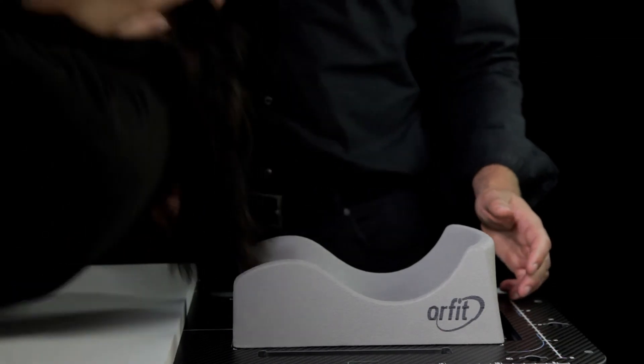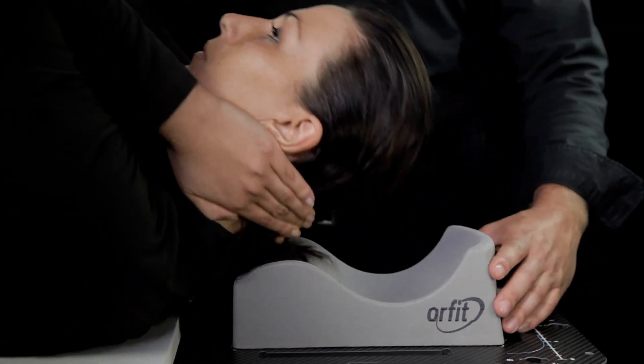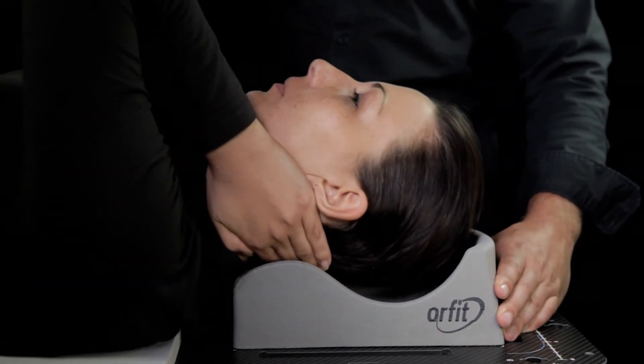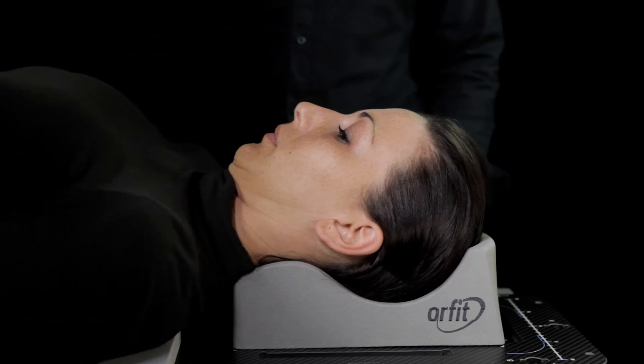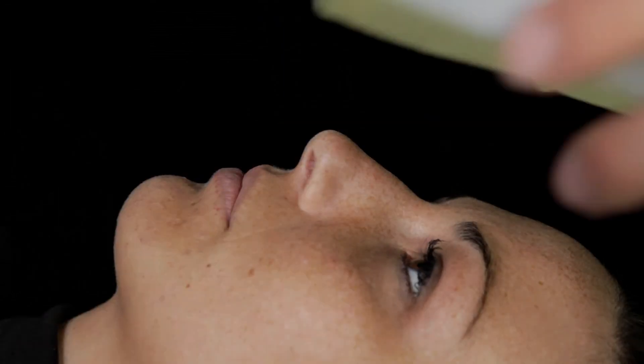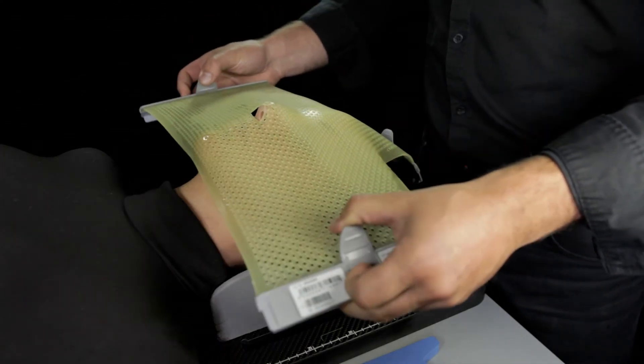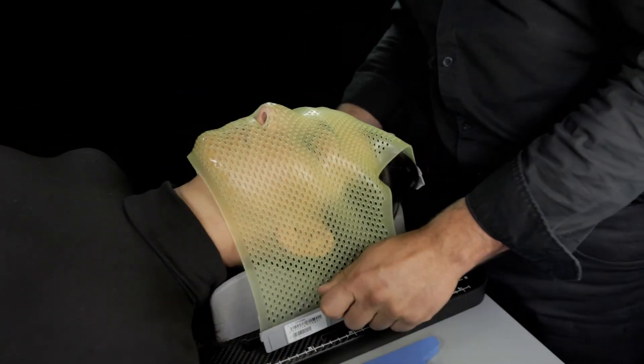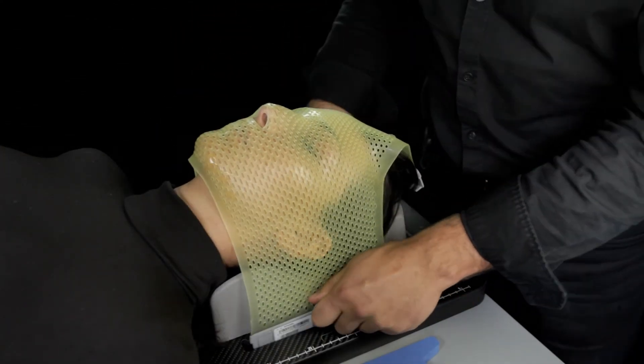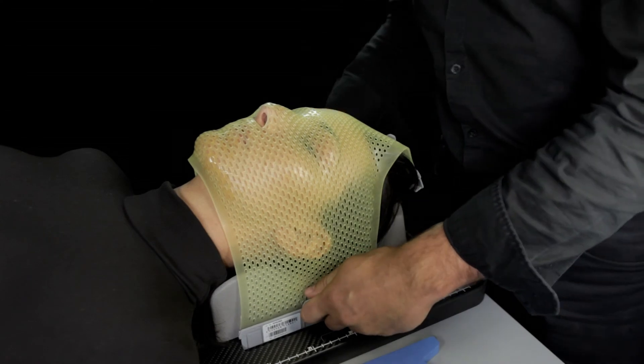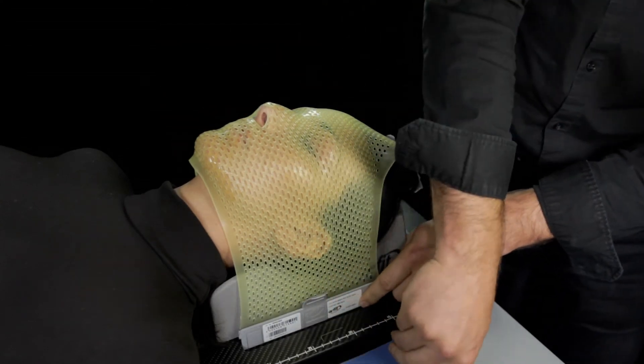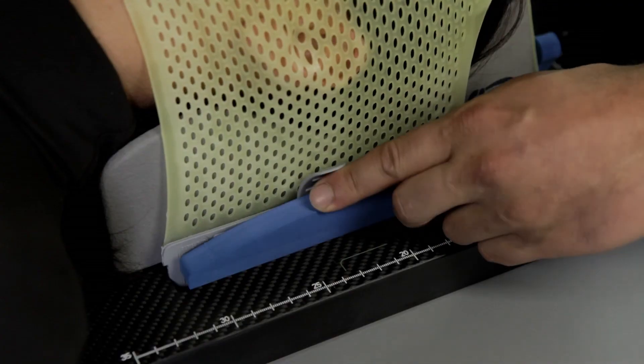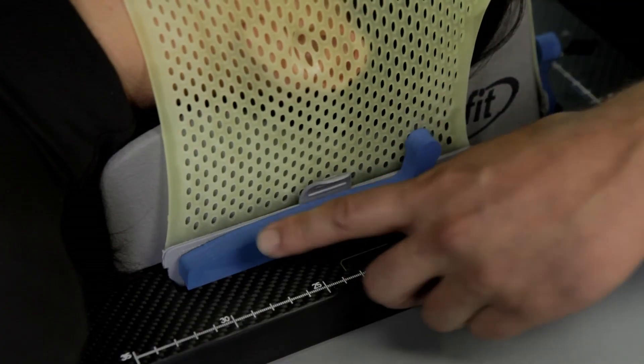To guarantee the precision of treatment, a head or a head and neck mask should be used. These masks are available in different sizes and shapes and can be looked up on our website. You'll also find a number of instruction videos illustrating how to use these masks.